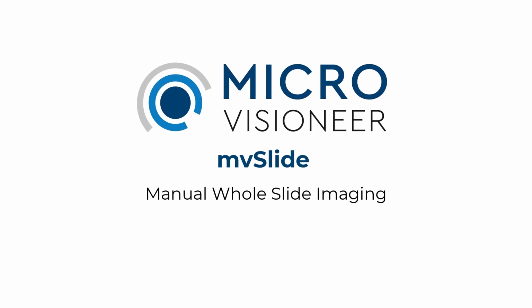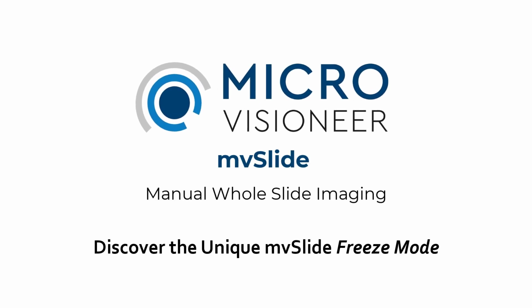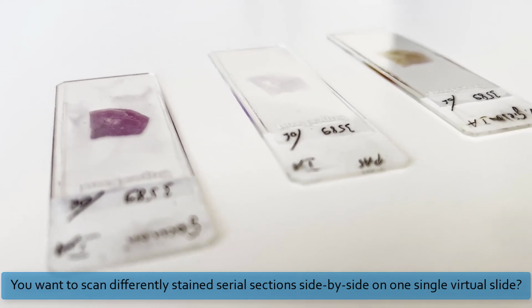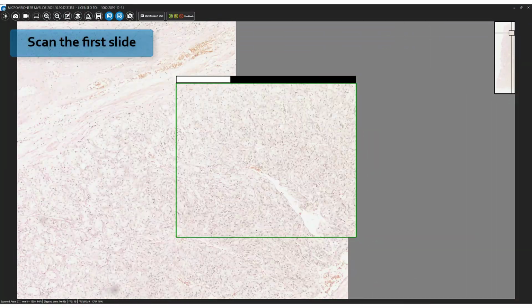Microvisioneer's mvSlide scanning software has a unique feature, the freeze mode. Discover what's behind it. Have you ever considered scanning sections from different glass slides into one virtual slide? The freeze mode is your solution.